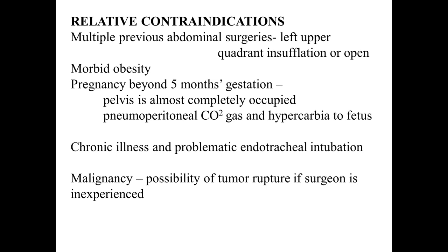You're going to be using your blunt artery forceps or a blunt instrument through that peritoneum to make a breach, so that you're not putting a sharp instrument and making a hole into something which is sticking on the undersurface of the umbilicus. So you're going to be using a blunt instrument and entering into the abdomen in an open way.